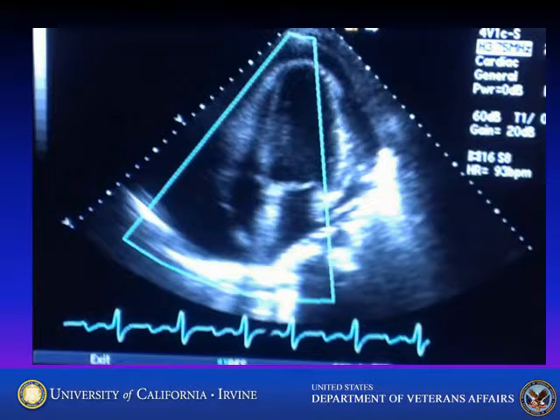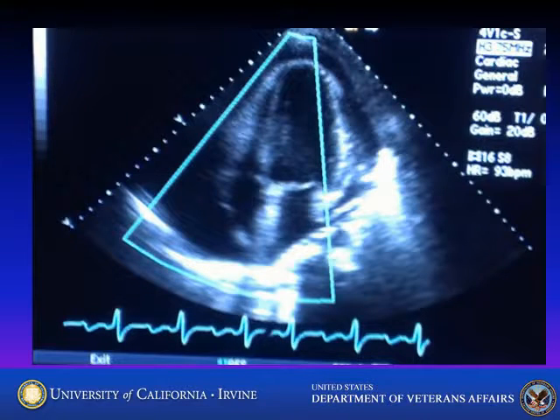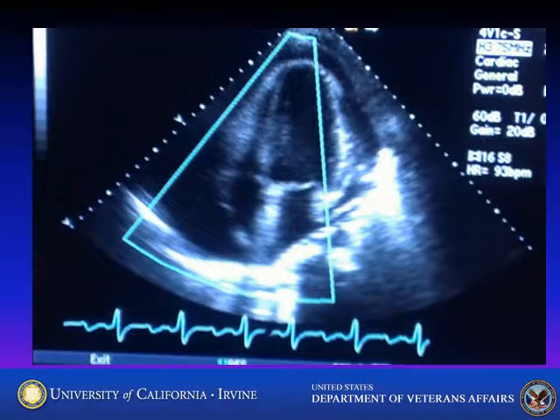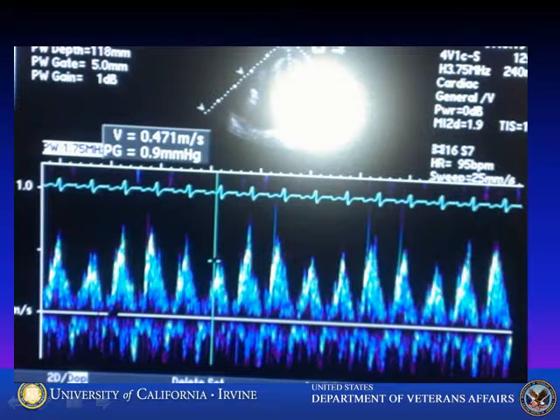The diagnosis also begins with the echocardiogram. Here is a still frame from an echocardiographic image, which was transmitted by cell phone to the physician at home. You can see the pericardial effusion around the heart — the black area outside the white border of the cardiac silhouette — greatest from about 7 o'clock to 9 o'clock. It is also consistent with right ventricular and right atrial collapse during inspiration and diastole, and a greater than 25 percent decrease in mitral flow velocity, consistent with tamponade physiology.